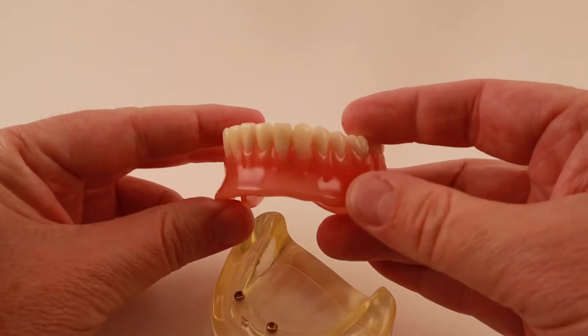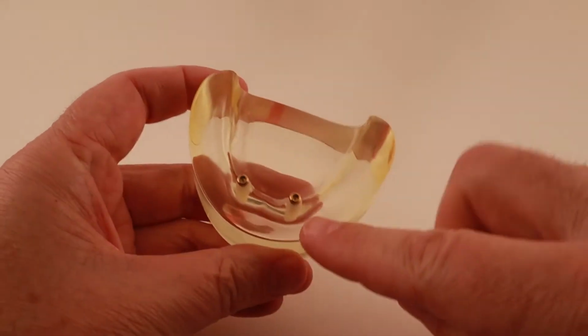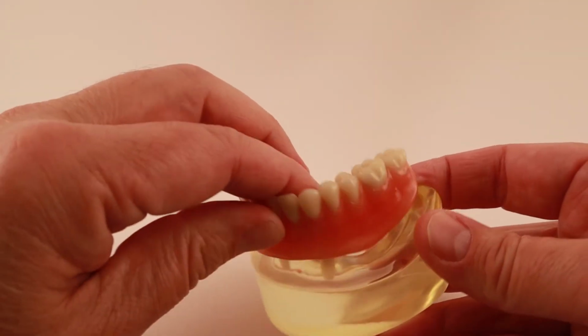There are two different types of overdentures. One is called an implant retained overdenture, which means the implants hold the denture in so that it doesn't move around, but the implants don't hold the denture up, which means that the denture is held up by your gums.